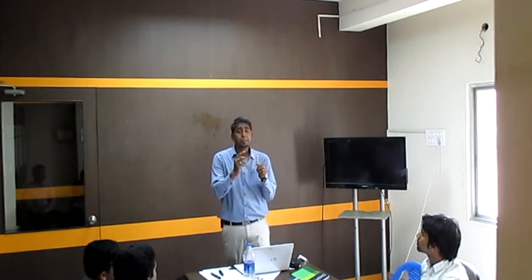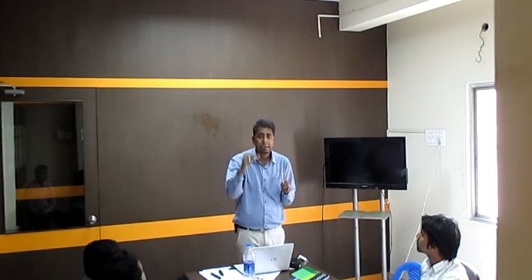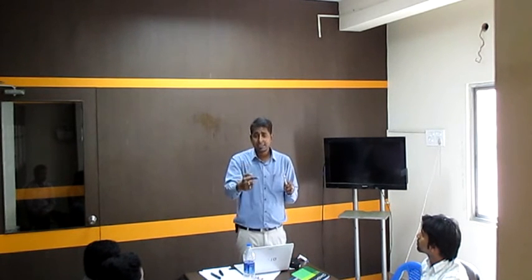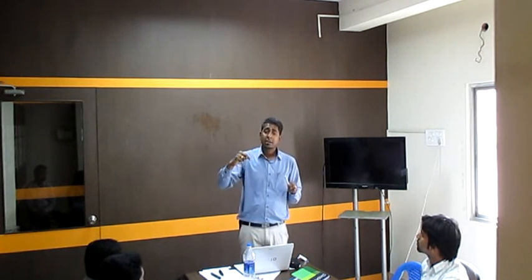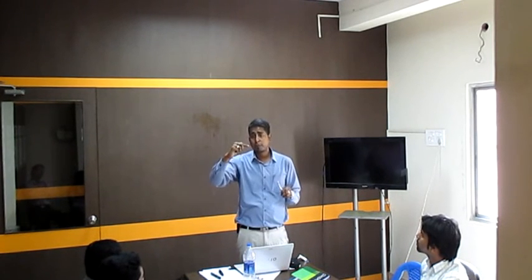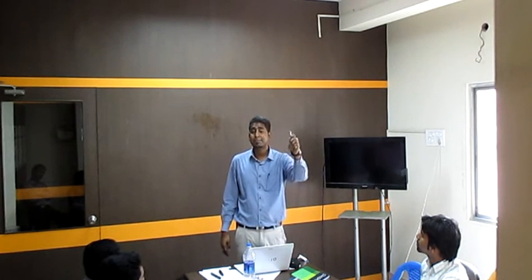Why? Because the feedback from the burr cutting enamel is different, the feedback from the burr cutting dentin is different, and the feedback from your file into the different zones of the pulp chamber would be different, and that has to be sensed by a dentist.